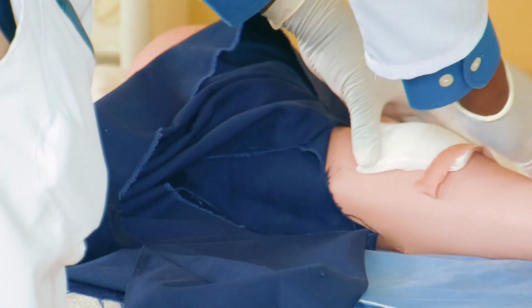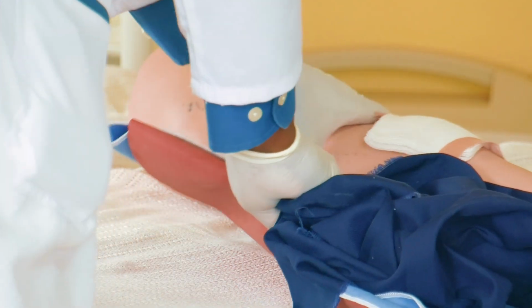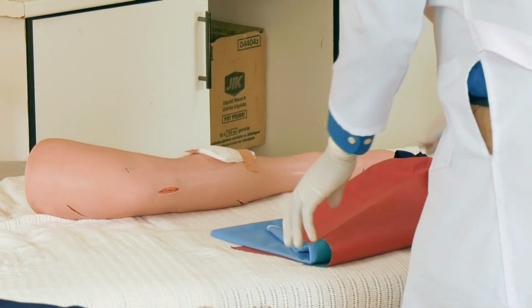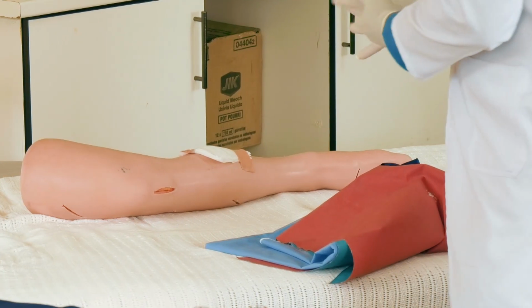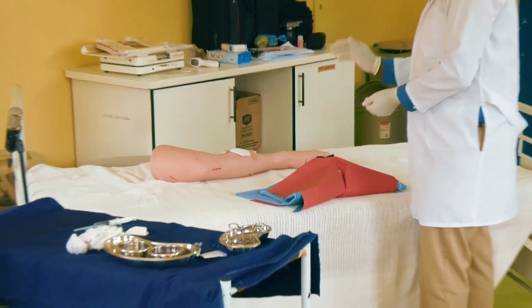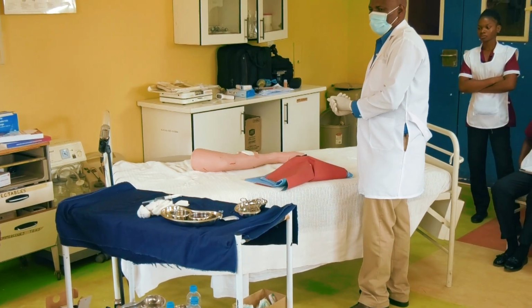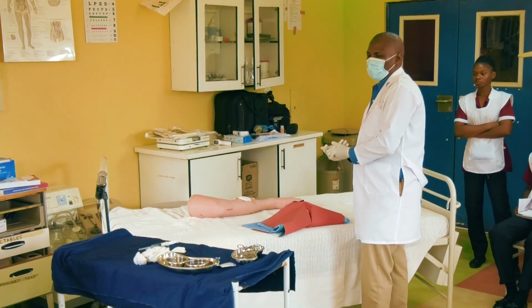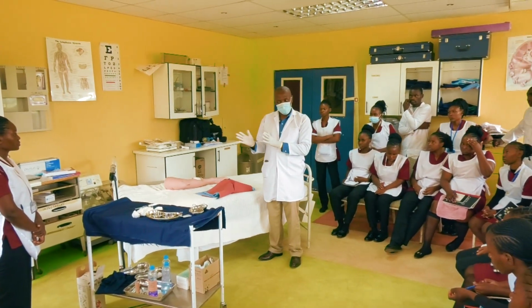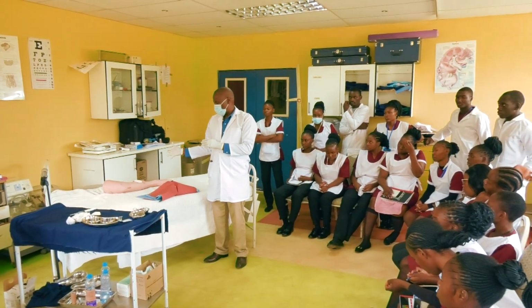Everything secured. Thank the patient for the cooperation. We'll be coming to do this, or you give IEC regarding wound healing and everything else. Then remember, this may be an outpatient. The patient may be going home. Tell them to come back after between 5 to 7 days, depending on the wound.